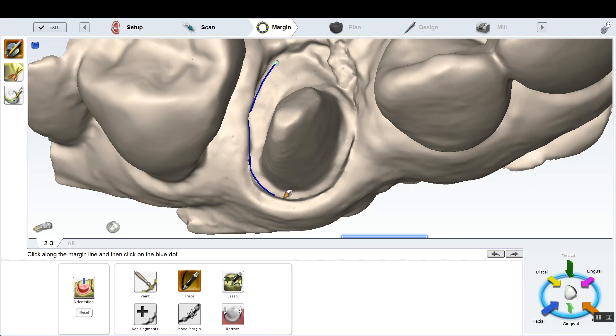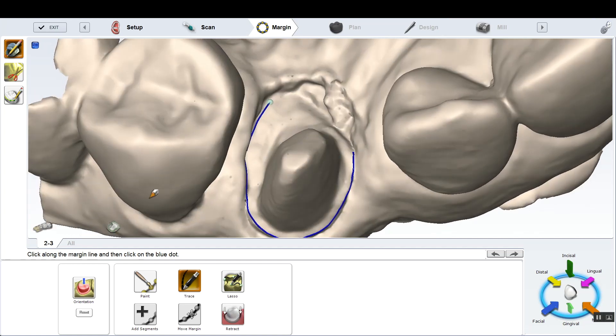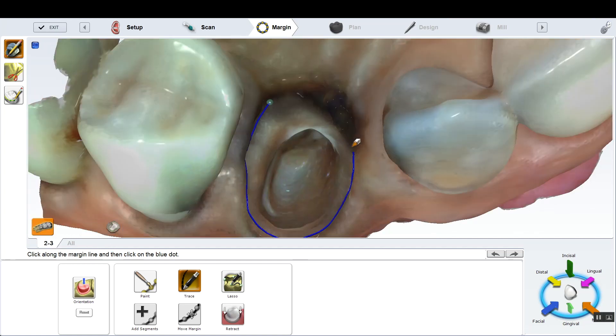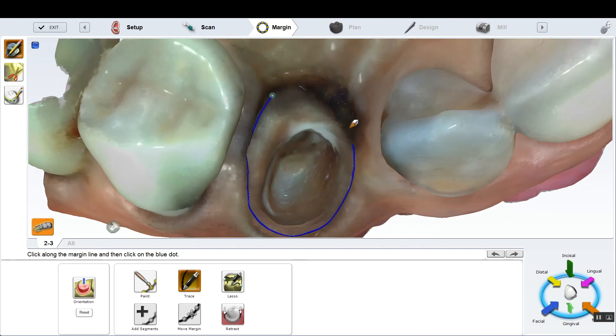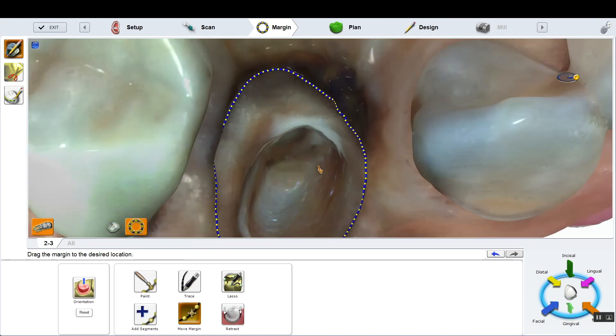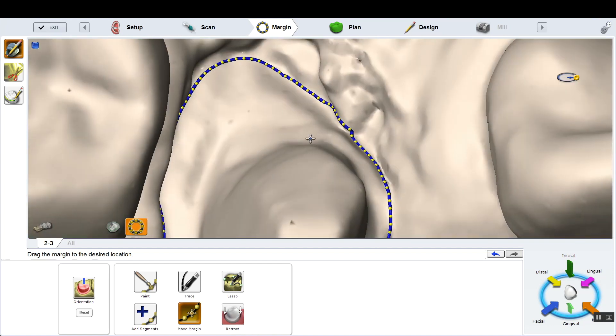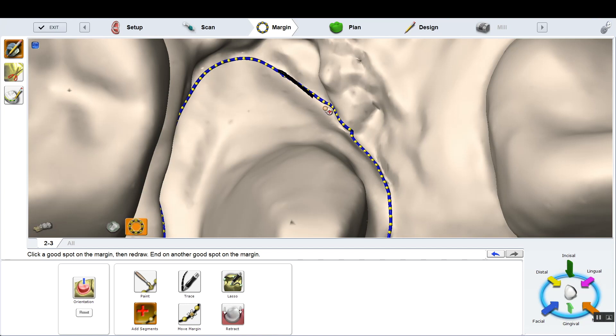What happened was, and this is kind of super common, we had an ill-fitting temporary on this tooth for I don't even know how long. And the tissue, in other words, the temp was short of the margin. So the tissue completely overgrew the margin everywhere. And so when the student went and refined their prep, you couldn't see that lingual like that, how the tissue was kind of over it by five miles. Just learning experiences for the student and stuff like that.